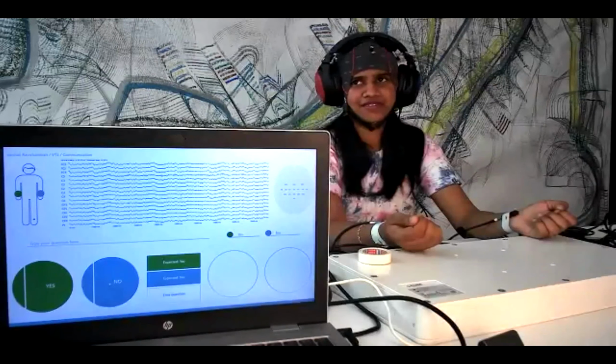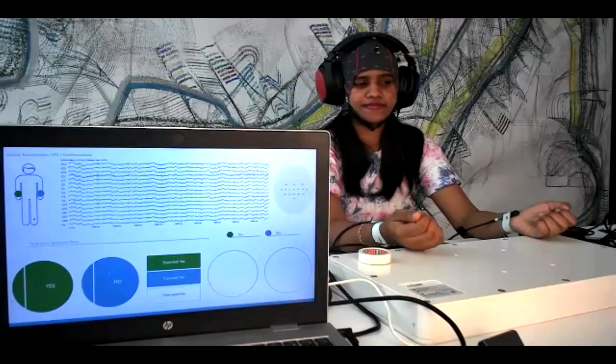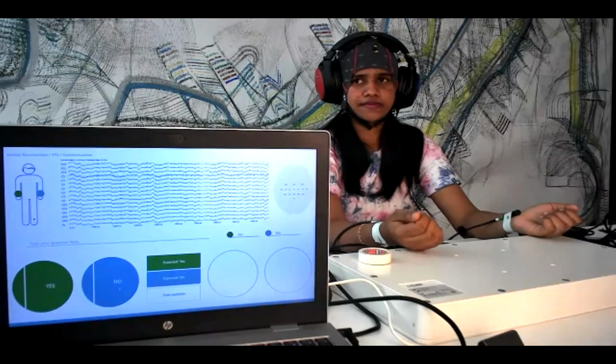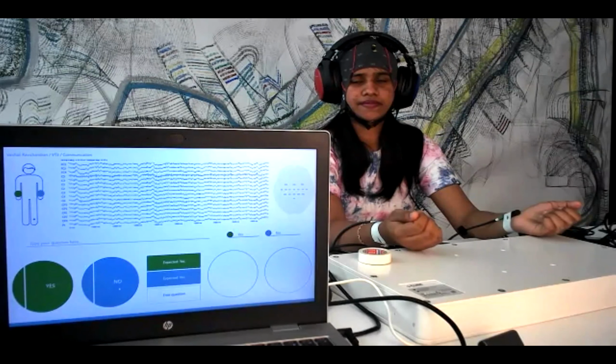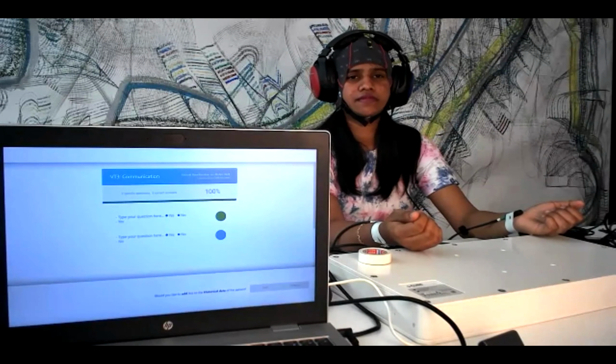Perfect. So great. So we see again, the color is changing to blue, which corresponds to the left side, and that's the no answer. Perfect. I think given the time, I will stop the session here. So I will still save the data.